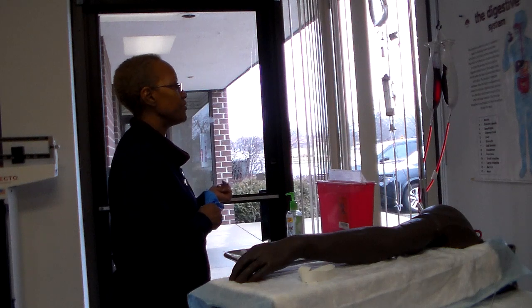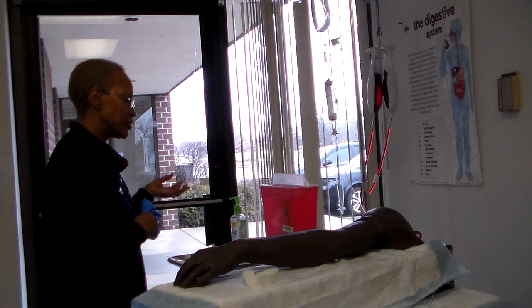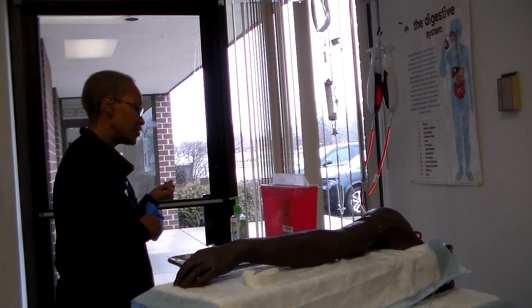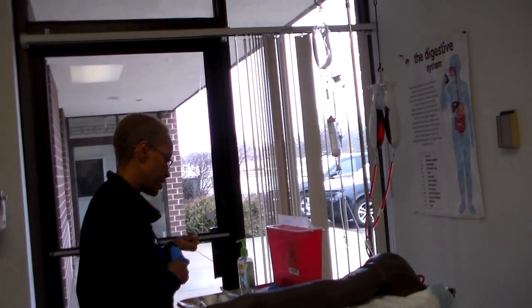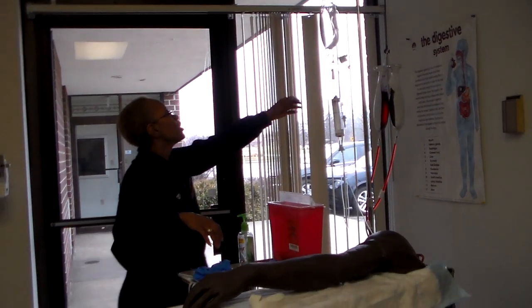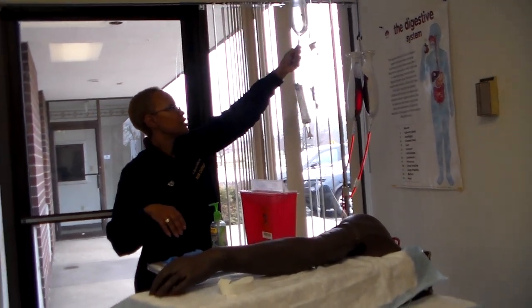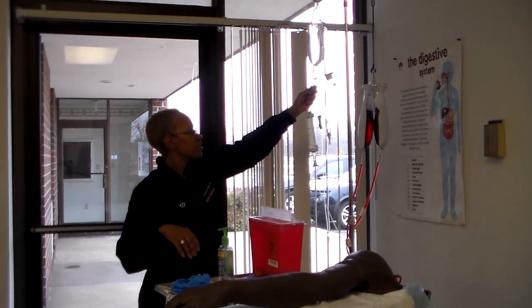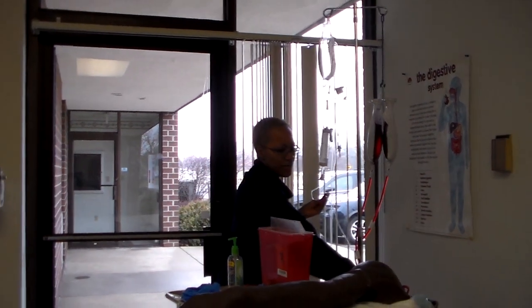So you're going to look at your IV fluid. We did this out at the cart. We checked our solution for color, it's clear, clarity, and the expiration date on it. So each of them have an expiration date, so you want to make sure you check for that. Then you're going to, this bag is already spiked, but you will pull the tag off here, insert your spike into your bag. You're going to open up your clamp. Okay, wait a minute. First of all, I'm going to have my lower clamp off.